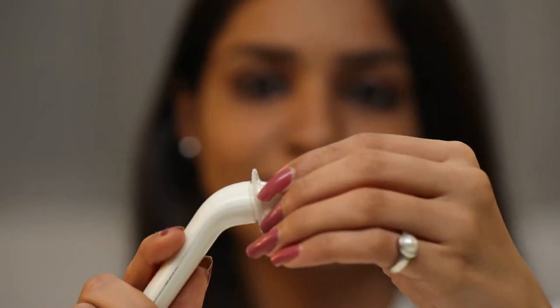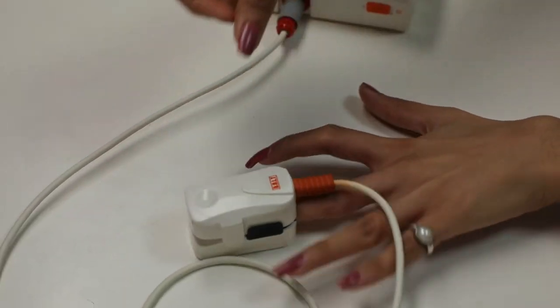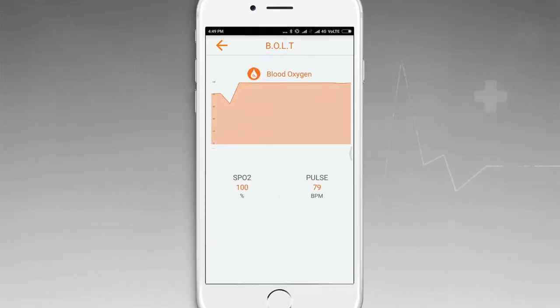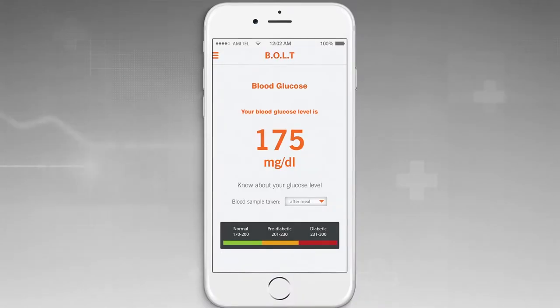Similarly, you can use Bolt to measure temperature, Blood Oxygen level, Blood Glucose, Total Cholesterol, and Hemoglobin levels.